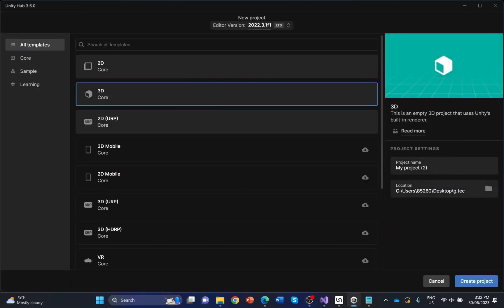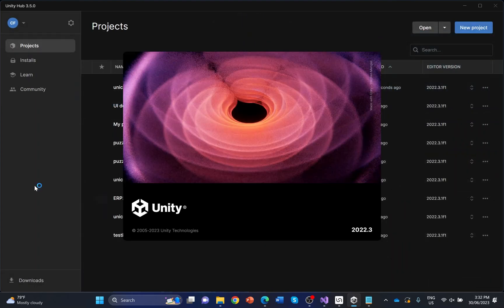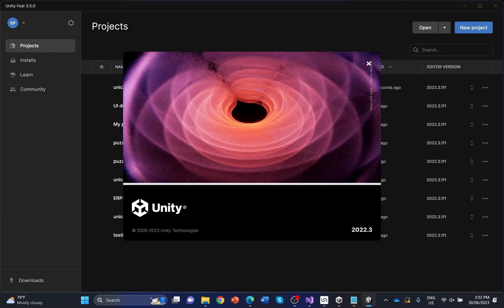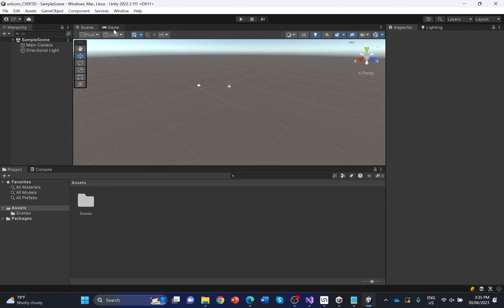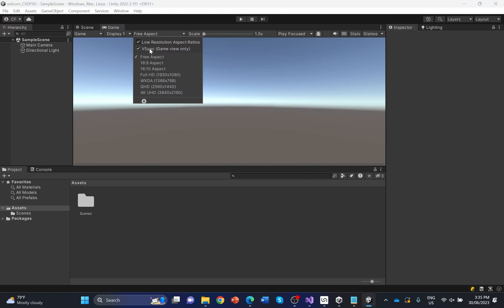First of all, you have to create a new Unity project. I select the 3D project for this example. Before starting with the actual game development, we have to apply some settings. Click the game tab and ensure that V-Sync is enabled. V-Sync ensures that the BCI can be synchronized with the computer display properly.